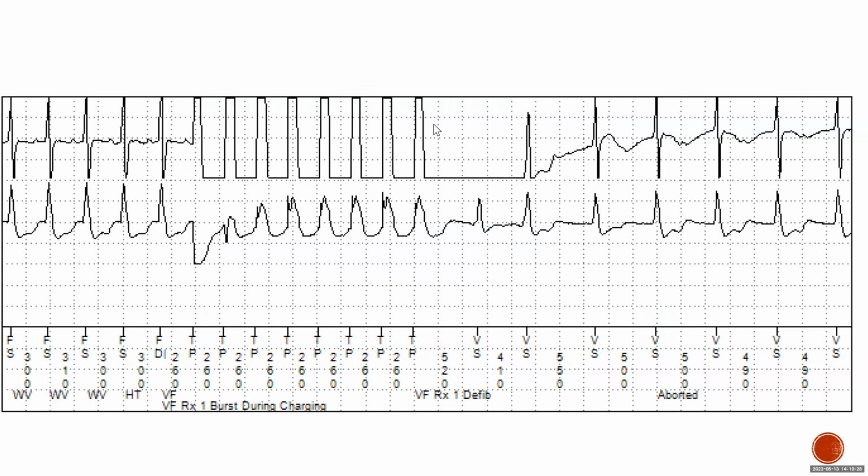Okay, we had different votes. Some people are saying similar, some different. This is a clinical judgment. The point is not to teach, but just the approach. I would say this is fairly similar. I'll show you an example of different. It goes up and then down, and then there's this slurred thing, up, down, slurred thing.